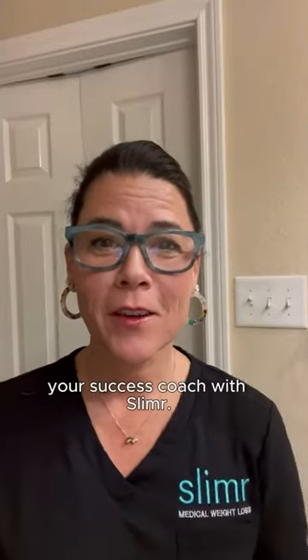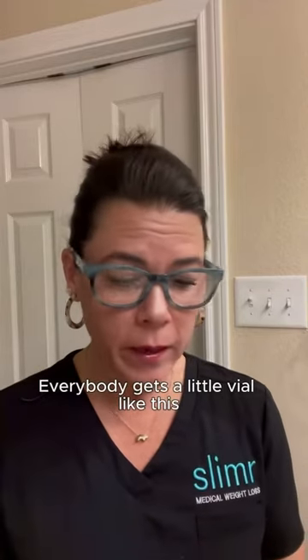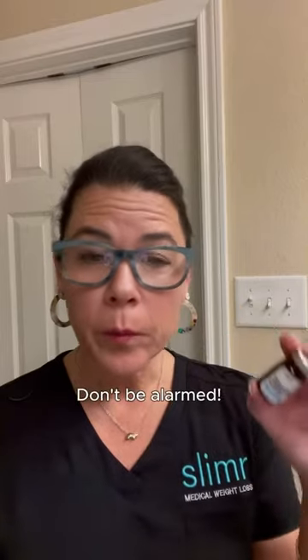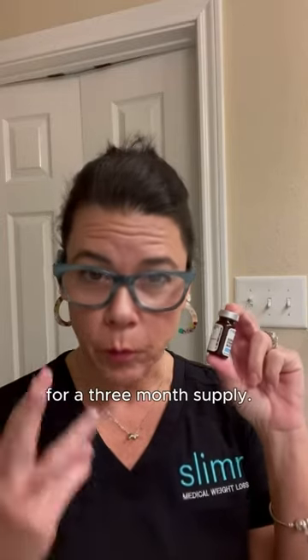Hey y'all, it's Leslie, your success coach with Slimmer. I'm going to come on here today and specifically show y'all how to load your syringes. Everybody gets a little vial like this when you start your medication. Don't be alarmed because it's not going to be full, but there's enough medication in there to last you your three months for a three-month supply.